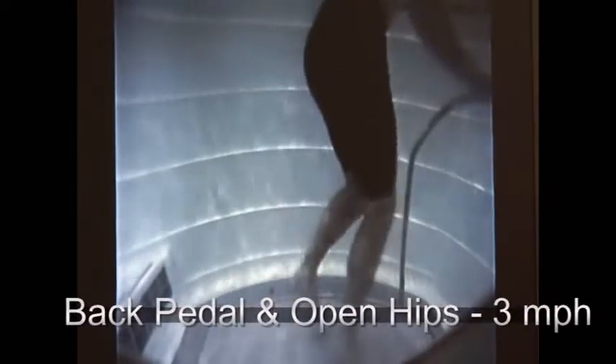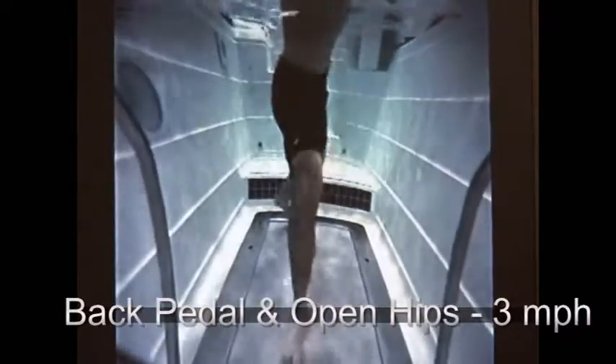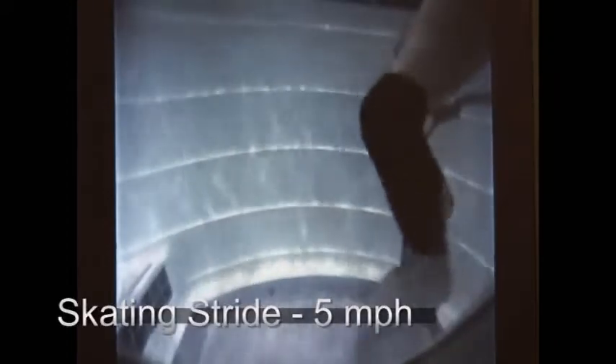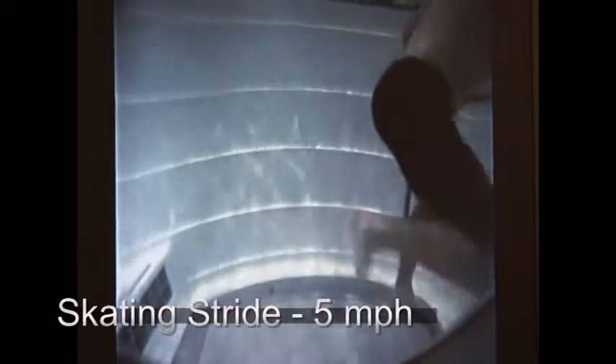That's when the majority of the injuries happen — right when you hit full extension and just as you start bringing it back. Obviously nothing can duplicate being on the ice, but I think this is fairly close. Just increase the intensity or the speed of the activity. The pool has video to where they have instant feedback — if they're not toeing off well enough with a high ankle sprain, or if they're not externally rotating their hip as much as I want, I can see right away. They can look at the TV in front of them and understand what I want. So now it's going five miles an hour — increasing the speed, increasing the intensity, working the muscle harder, more of a reaction type rather than slowly going through the range of motion.